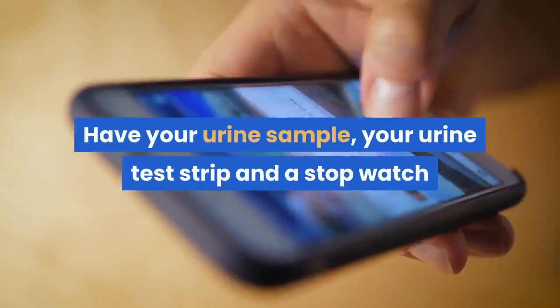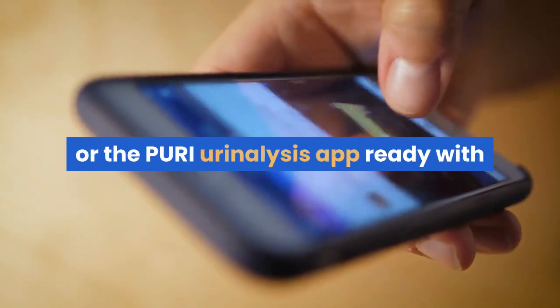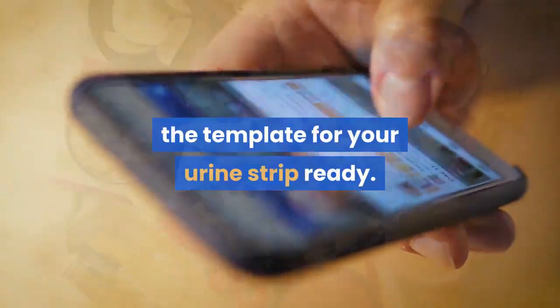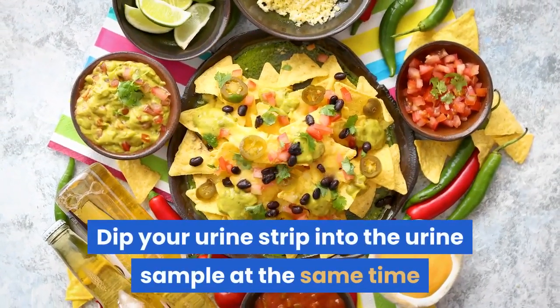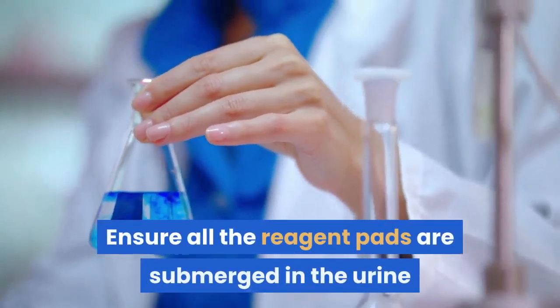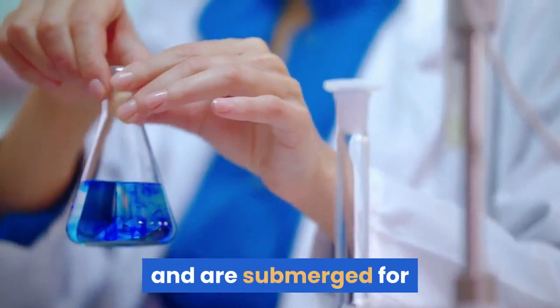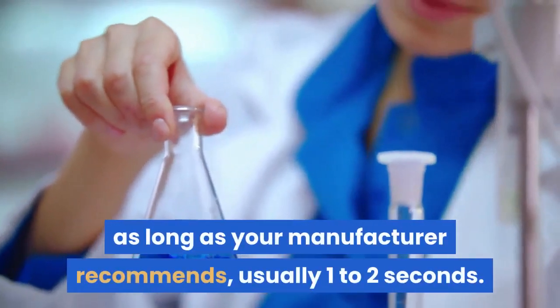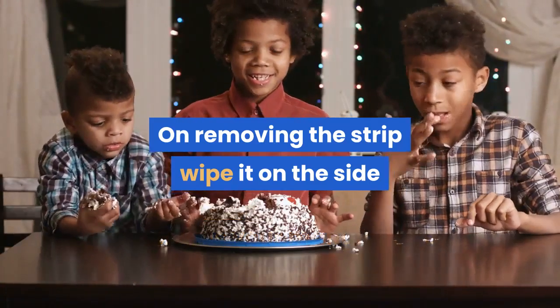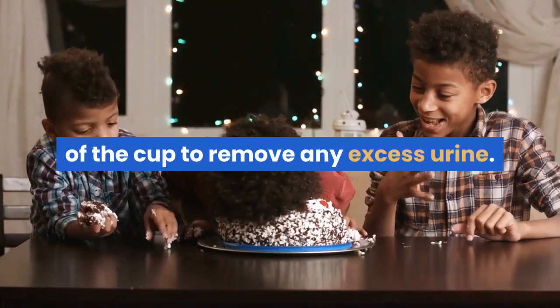Step 3: Conduct the test. Have your urine sample, your urine test strip, and a stopwatch or the Puri urinalysis app ready with the template for your urine strip. Dip your urine strip into the urine sample at the same time as you start the timer. Ensure all the reagent pads are submerged for as long as your manufacturer recommends, usually 1 to 2 seconds. On removing the strip, wipe it on the side of the cup to remove any excess urine.